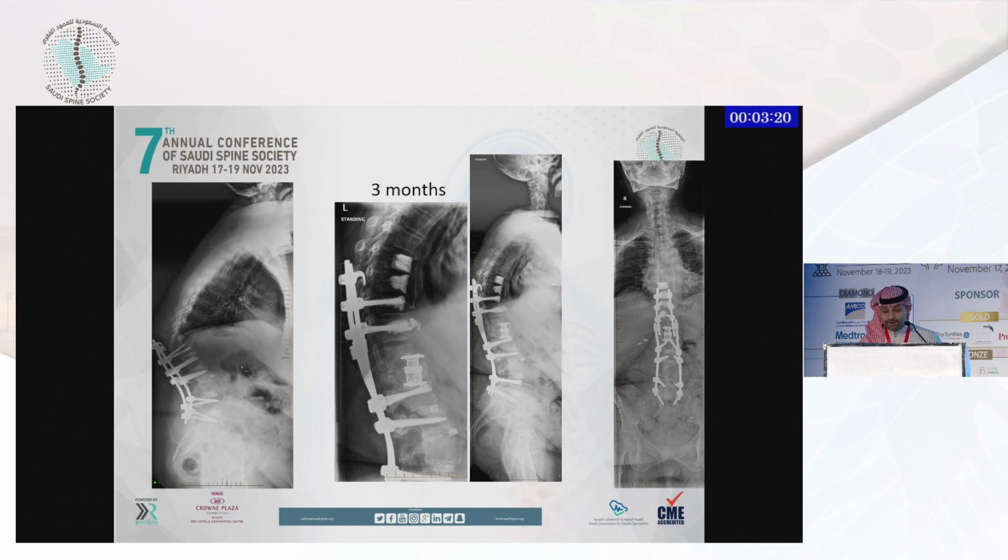So a vertebrectomy was done at the apex of the deformity, and probably this was discussed earlier at the adult spinal deformity session. We used the soft landing at the upper part, and vertebroplasty at UIV and UIV plus 1.